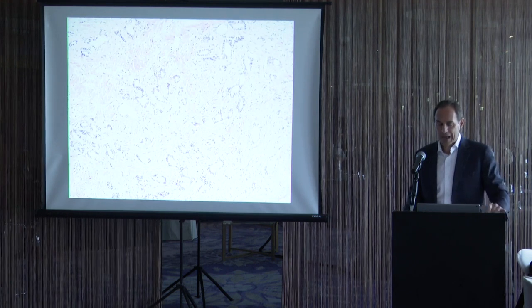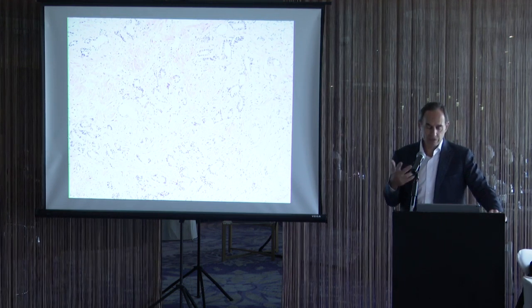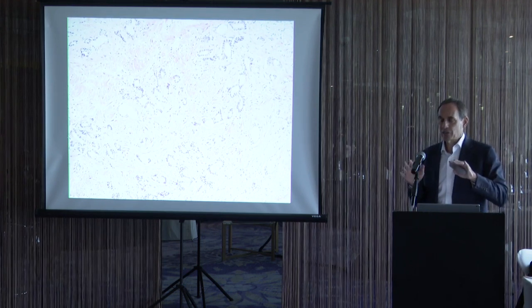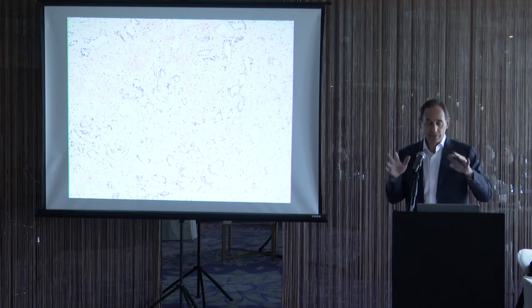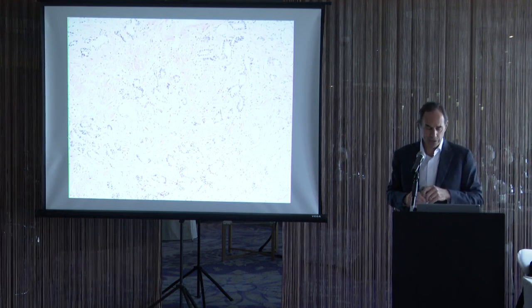Some patterns of atrophy that can cause more difficulty, there's one called sclerotic atrophy, where it's associated with a dense sclerotic stroma, where the glands can look more haphazard and infiltrative. But the key thing is to remember that these glands look infiltrative in a patch. They look infiltrative just by themselves, but they're not infiltrating in between the benign glands like I showed you with atrophic prostate cancer.